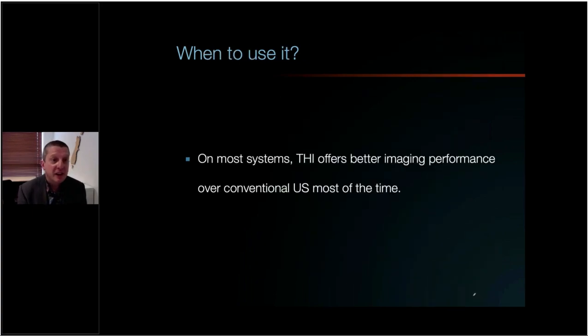The final question is, when should we use it? Well, on most systems, tissue harmonic imaging offers better imaging performance over conventional ultrasound most of the time. So you'll find that it is a default part of most of the presets that you'll be working with.